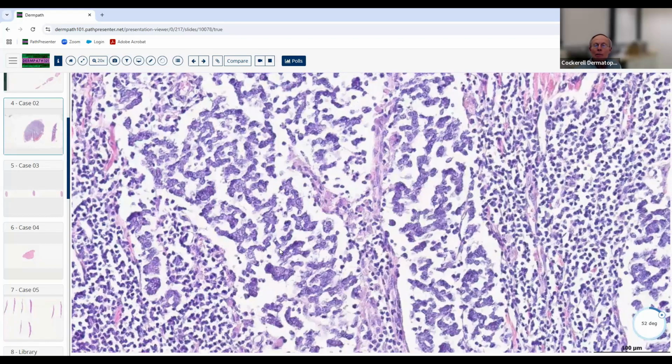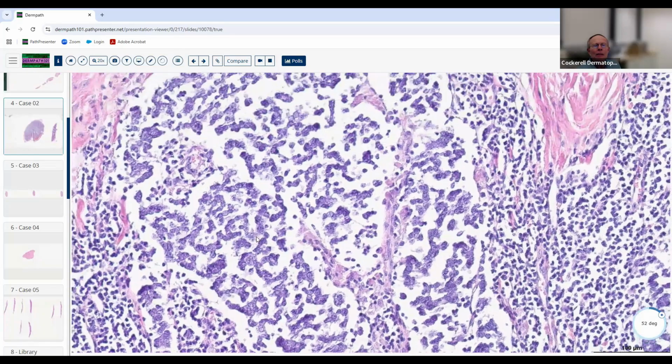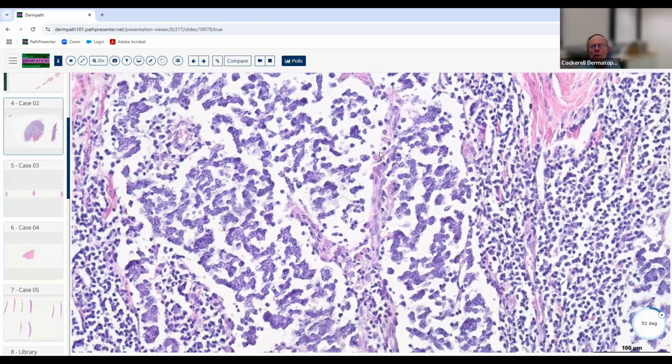The other thing to do is some immunostains directed to neuroendocrine differentiation. And there's about 4 or 5 of those. INSM1, which is an insulinoma marker, is directed to cells in the pancreas. Those will obviously highlight neuroendocrine cells because it's basically the same differentiation. Synaptophysin is another one that's pretty good for neuroendocrine differentiation. And then there's a couple others, chromogranin, and those are the main ones that we really look for.